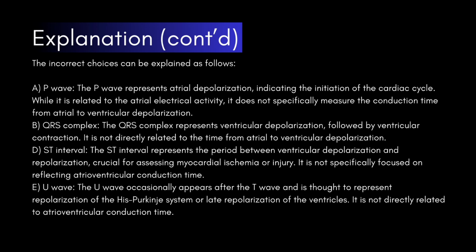It is not directly related to the time from atrial to ventricular depolarization. ST interval. The ST interval represents the period between ventricular depolarization and repolarization, crucial for assessing myocardial ischemia or injury. It is not specifically focused on reflecting atrioventricular conduction time. U wave. The U wave occasionally appears after the T wave and is thought to represent repolarization of the His-Purkinje system or late repolarization of the ventricles. It is not directly related to atrioventricular conduction time.